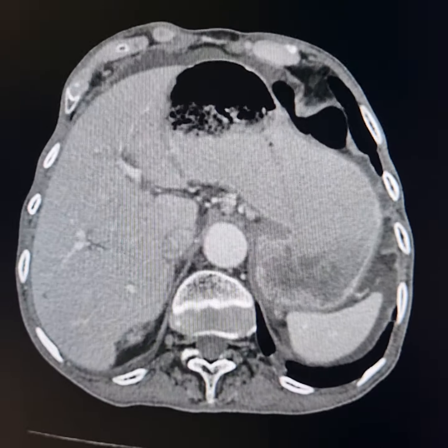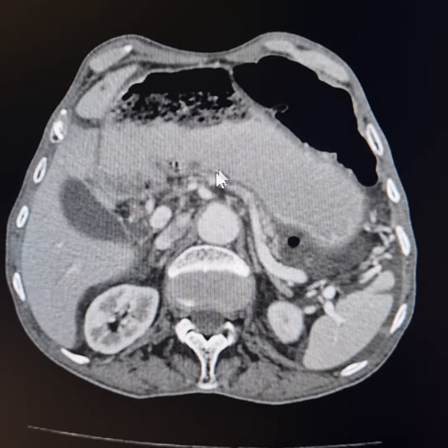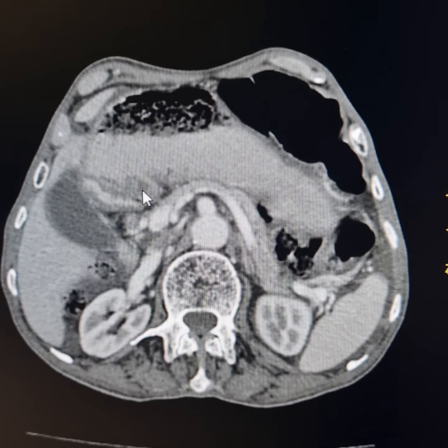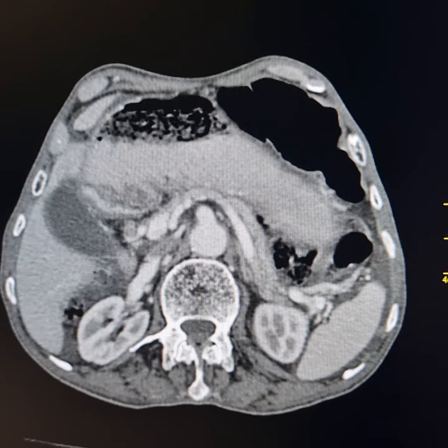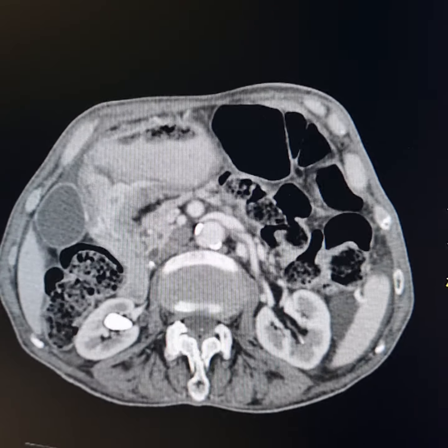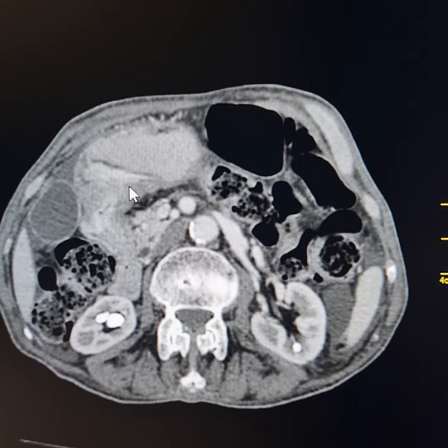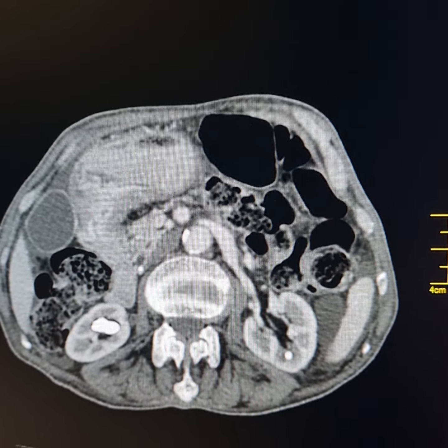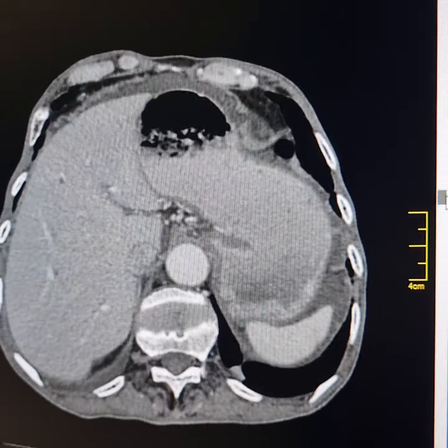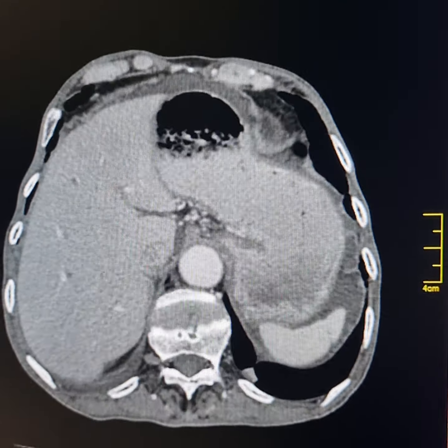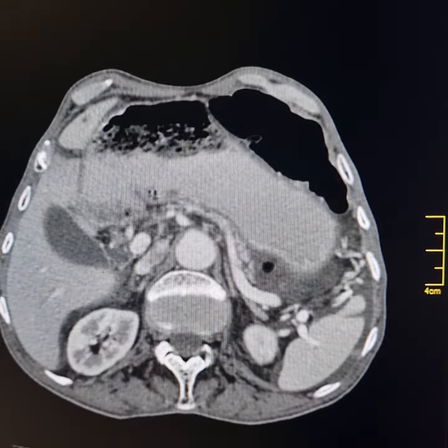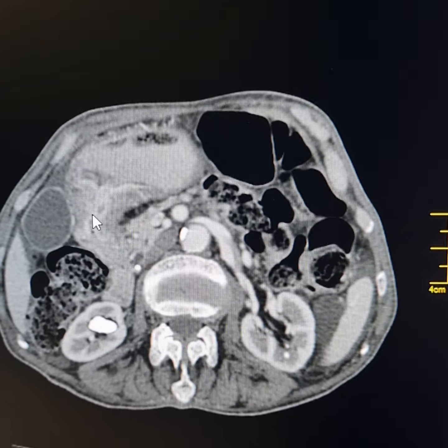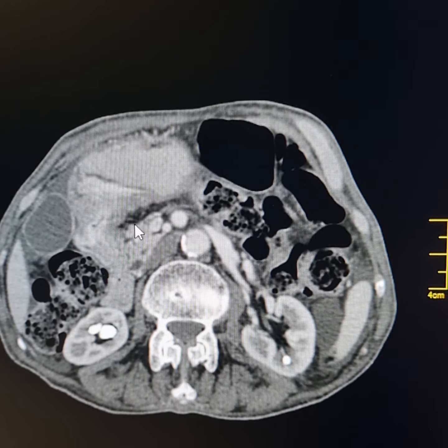On endoscopy, there was a mass in the region of the pyloric antrum and pyloric canal. This mass involves the posterior wall of the pyloric antrum, with circumferential thickening of the pyloric canal. There is significant narrowing of the gastric outlet. The proximal stomach is dilated, with a significant amount of food residues present. Adjacent fat planes are normal.